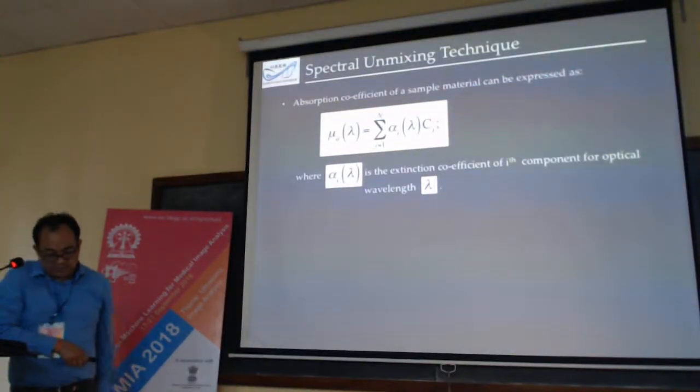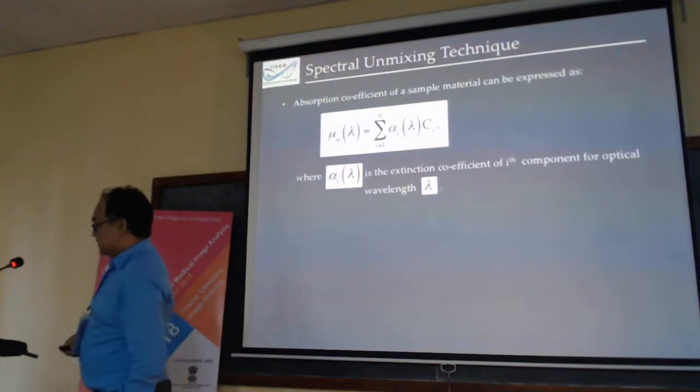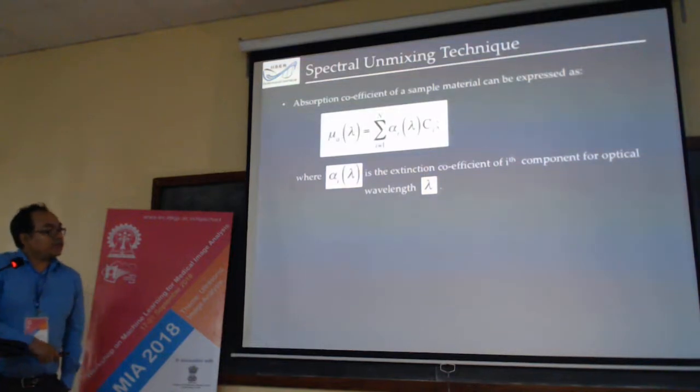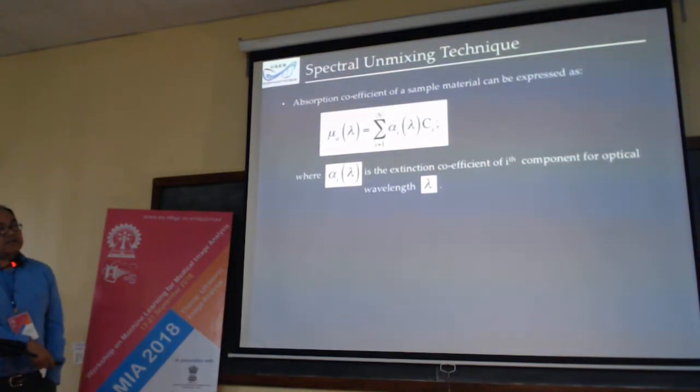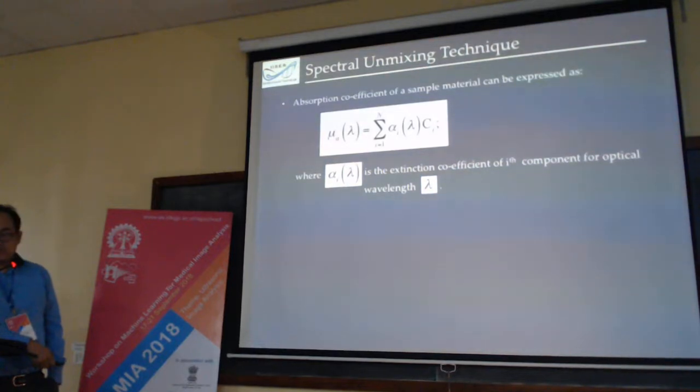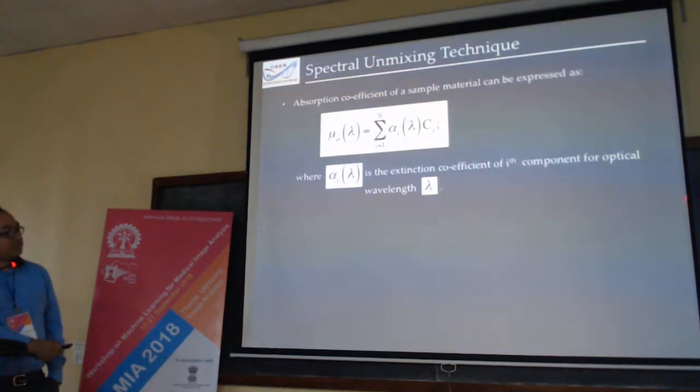Yeah, one more that I would like to discuss. This is the last part. From the microscopy that I have shown, the velocity of sound and the velocity of flow we can measure, and the elastic property we can measure. In a similar way, what are the other physical parameters that we can extract from the measured photoacoustic signal? From the photoacoustic signal we can get the distribution of the absorption coefficient, which I have already discussed.